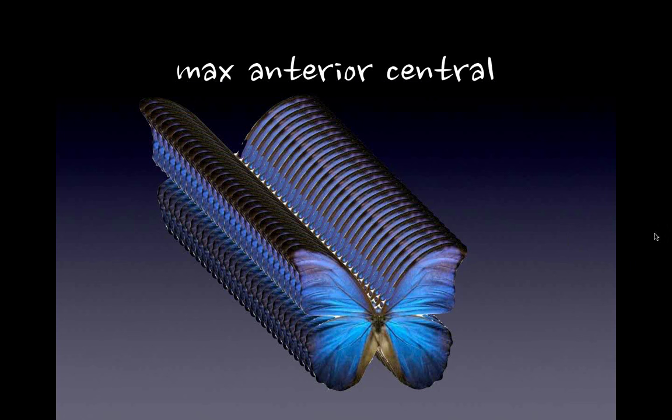Do you place all your composite shades down and then cure, or do you place the lingual layer down, cure, and then cure as you layer? I put the lingual layer down, cure, and then start with each layer, and I cure each layer. That's a good question. So let's continue on.